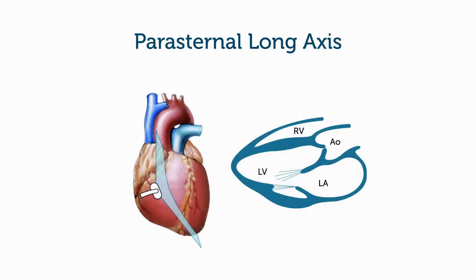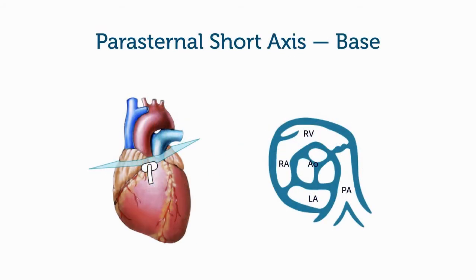And now, I will just hand it over to Anna and let her review some of the things we saw in the last chapter. Yes, when we were talking about aortic valve stenosis, we were imaging the heart from a parasternal long axis view, which cuts the heart, now you know very well, somewhere here through the aortic valve. And we used also the parasternal short axis view at the base, where the aortic valve is always in the middle of our view. But now we want to see if you are ready to make your own diagnosis.